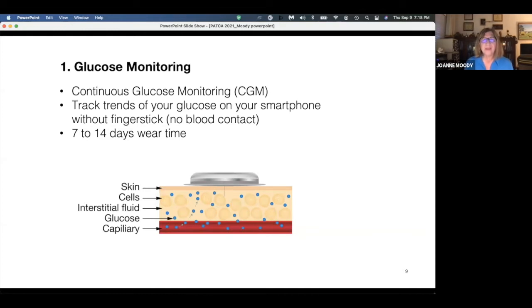So this has made it safer and more effective for the patient and the essential workers to work with patients that are ill and happen to be diabetic and need to have the glucose monitoring going on. So this has caused quite an increase in the usage of these devices. And in fact, there are companies a bit worried right now about scaling up in the next year or two. The quantities are going to need to continue to grow this product market.